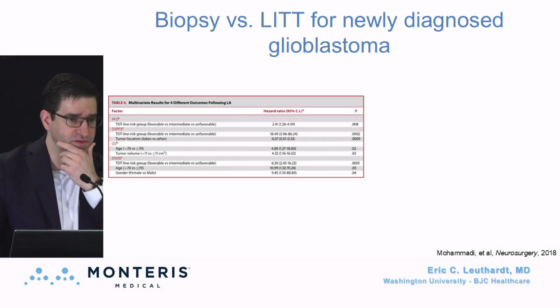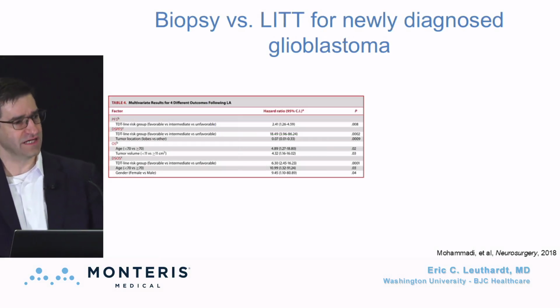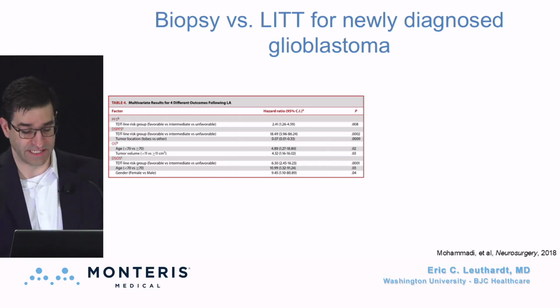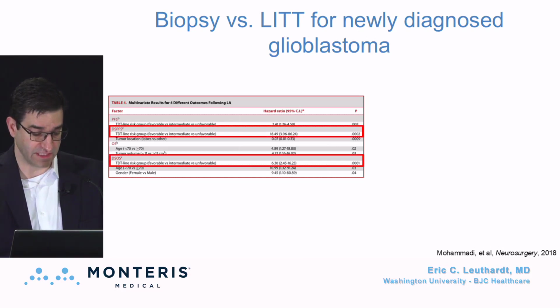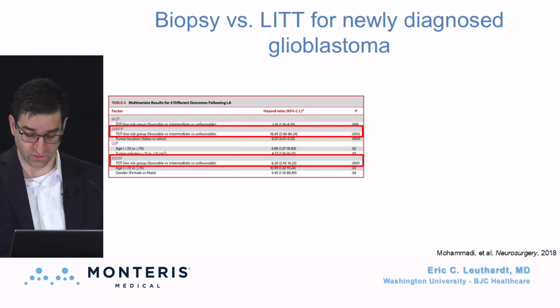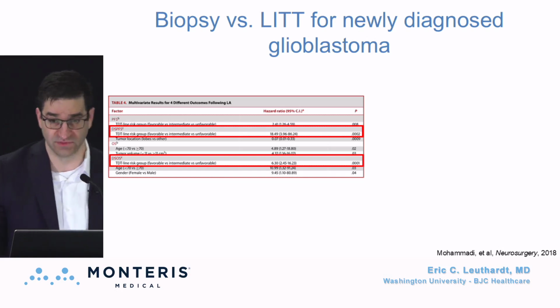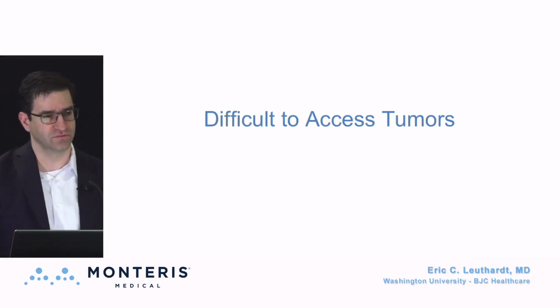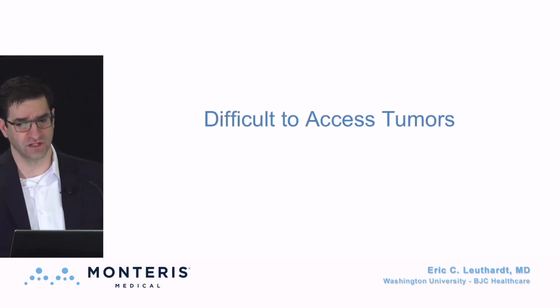And so we partnered with Cleveland Clinic to ask, okay, for these inoperable tumors, how do these compare to what you'd usually do, which is a stereotactic biopsy? And it was pretty clear that if you sufficiently treated the volume and the tumors weren't too large, they did demonstrably better than stereotactic biopsy. And so that further confirmed for us that for these inoperable tumors, laser was a really meaningful option. So then I'd say we started to expand our scope for what other tumors we can start to think about addressing here with laser.